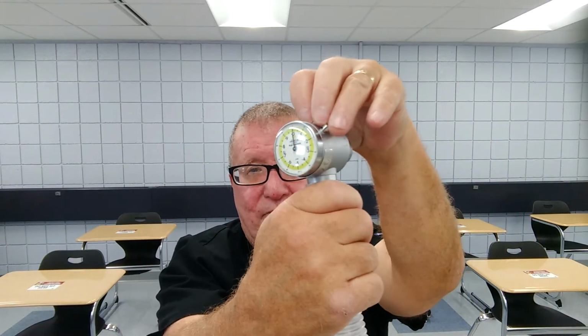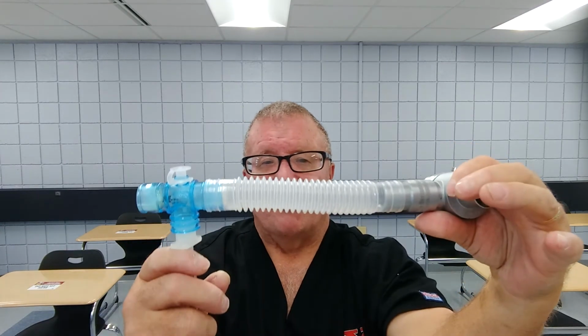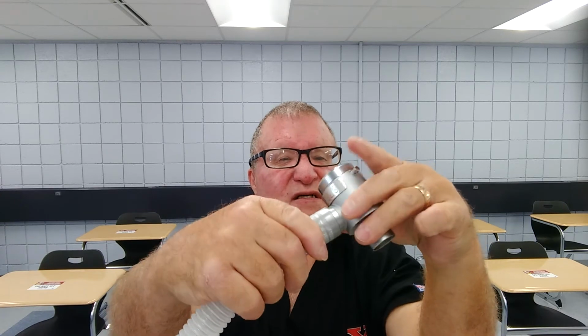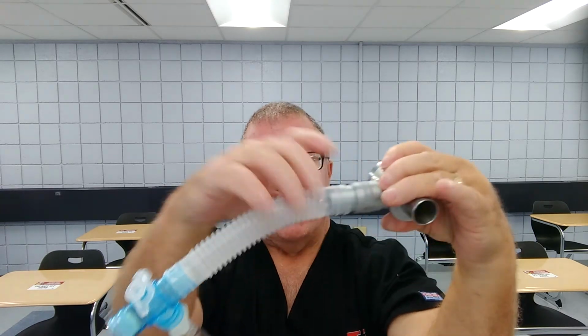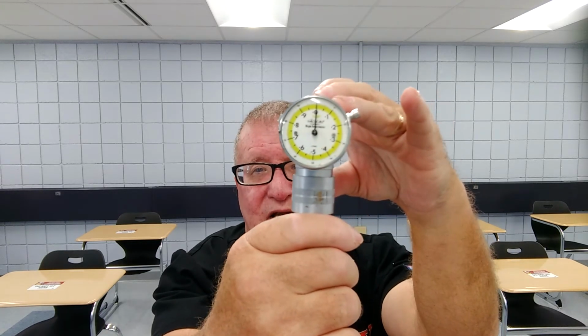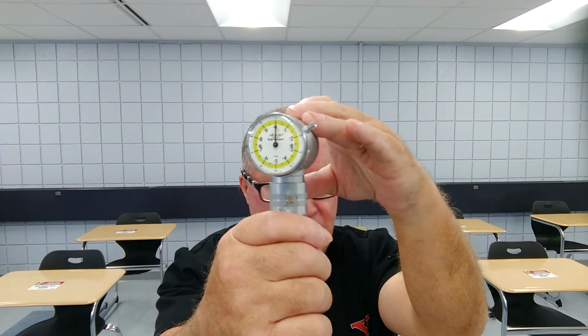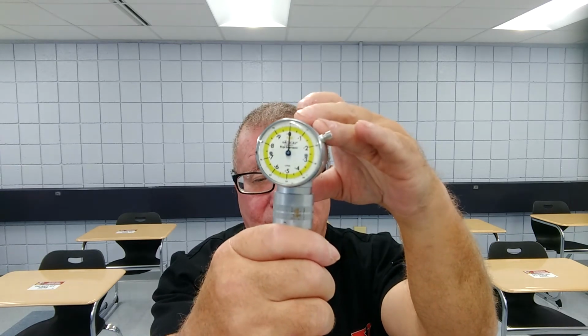Again, I hit the reset button. I'll watch them breathe for a minute. After a minute, I hit reset, and I'm ready to go. Now, when the patient breathes in, I'm going to give you an idea what it looks like here. Again, always use a filter if you're going to play with one of these. Okay, now it's been reset. The number is at 0. So what I'm going to do is breathe for approximately 1 minute. I don't have a watch with me, so I'm just going to approximate it.